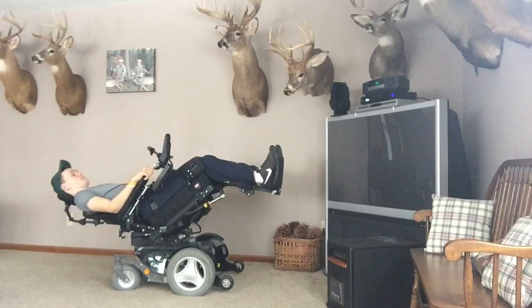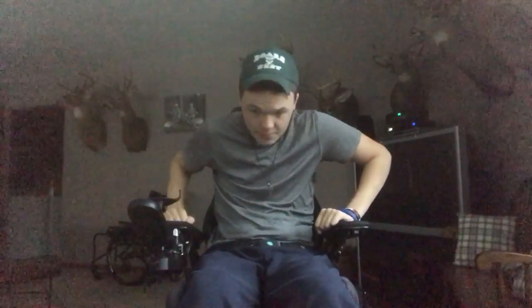You can also do pressure reliefs in a power chair by the same way we did in a manual chair. So first off, you want to loosen your seatbelt, and then you want to put one hand on the armrest, and I normally use one elbow on the armrest as well because I get more force rather than pushing with both hands like this.